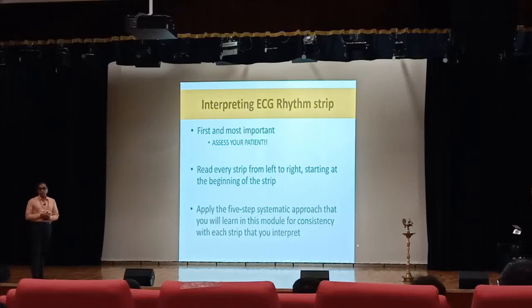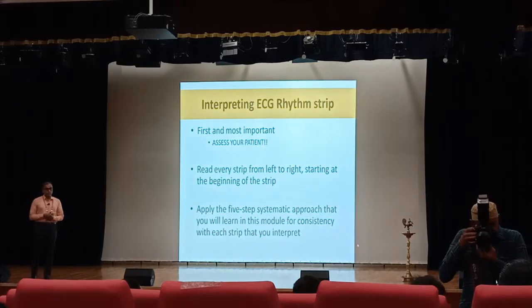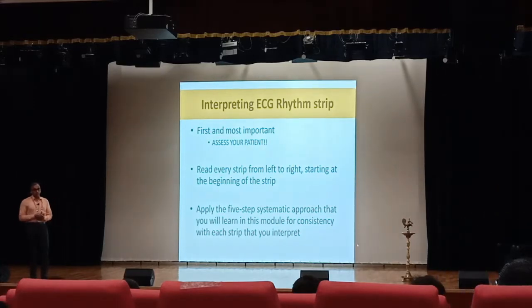Easily identify most of the rhythms. But again, a word of caution: we are not making you an expert of ECG, because that's the job of the cardiologist. But definitely we can make sure that you understand what the lethal rhythms or pre-cardiac arrest rhythms are, which you must identify and treat quickly so that you can prevent the cardiac arrest.